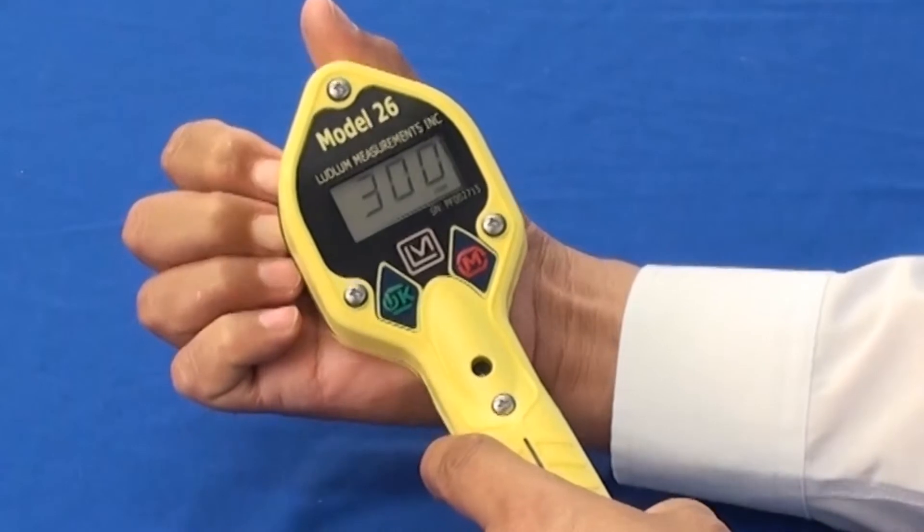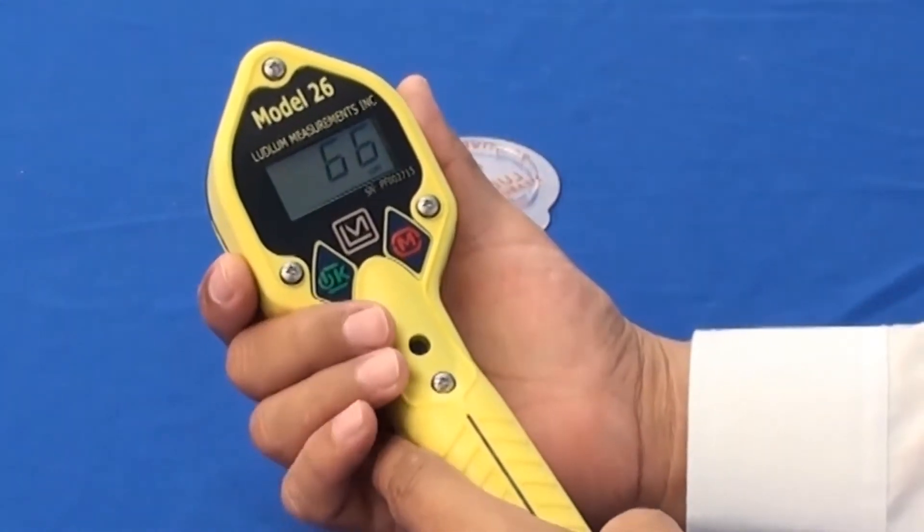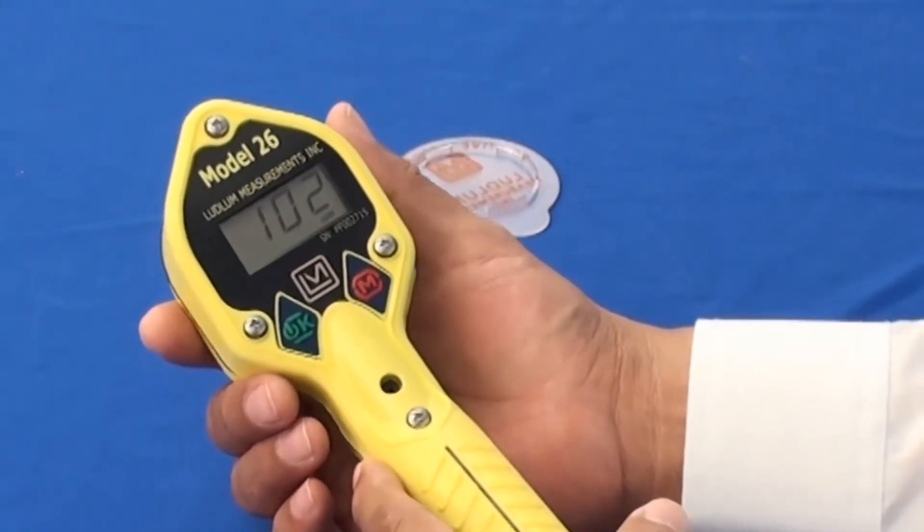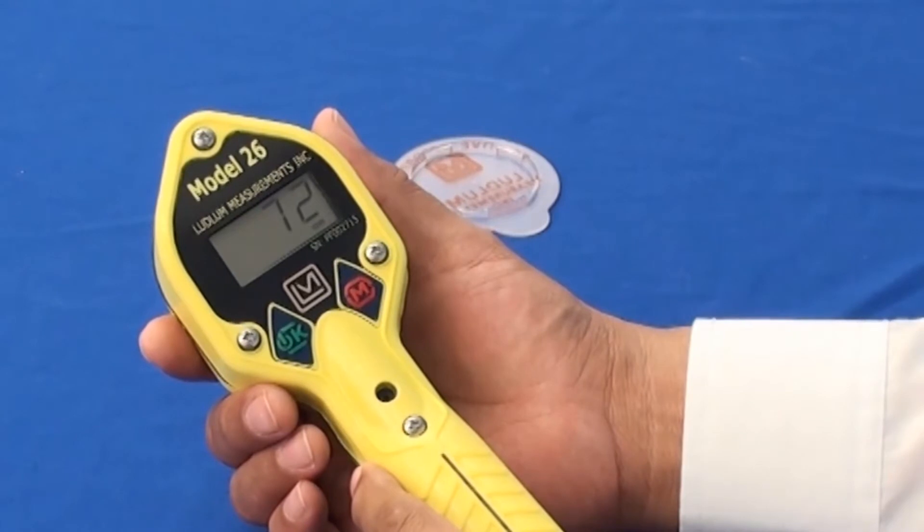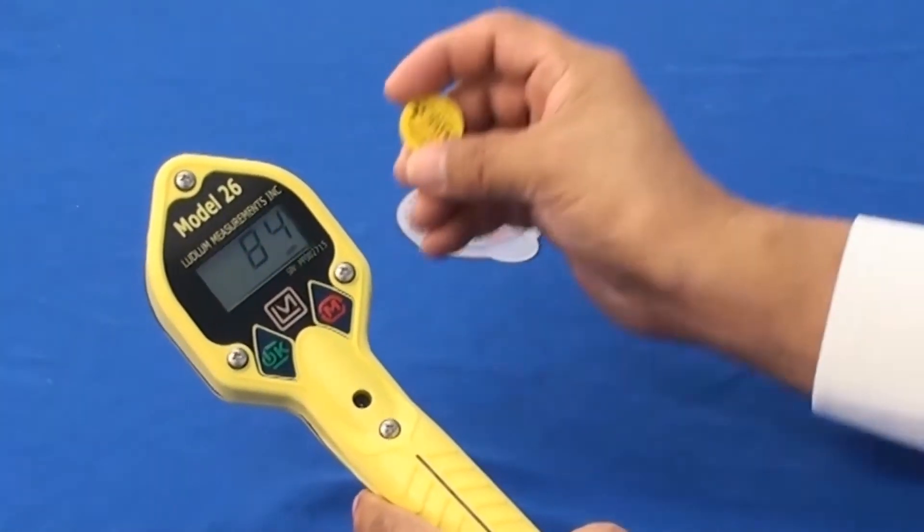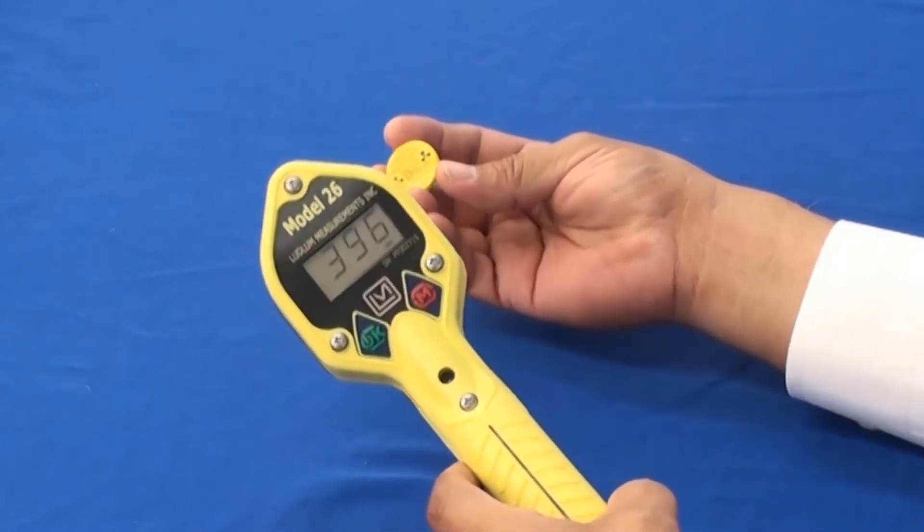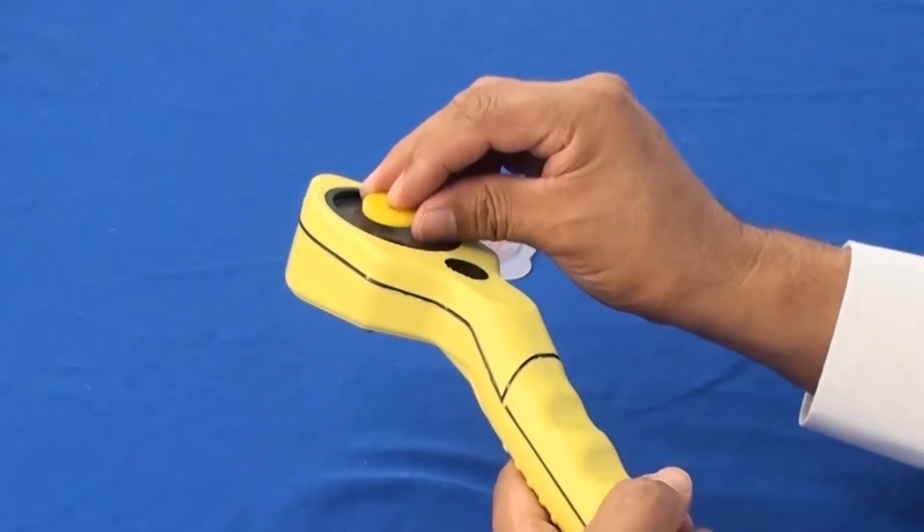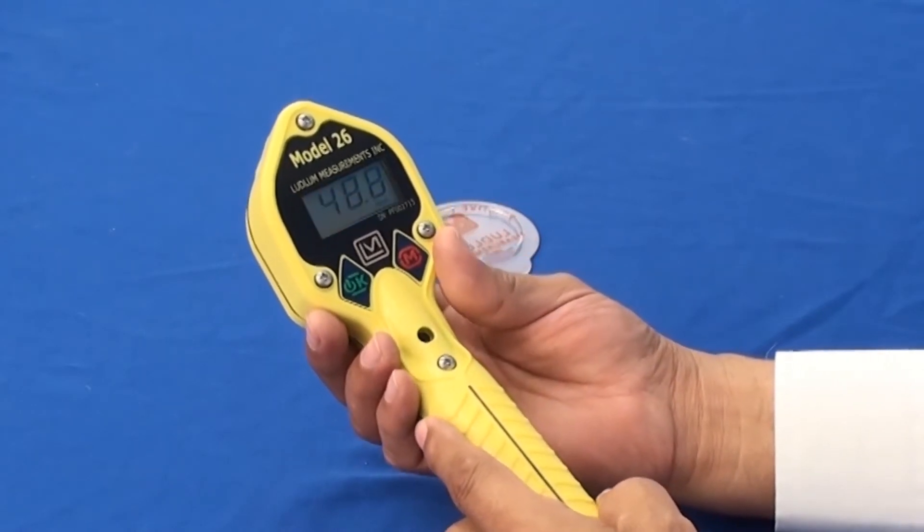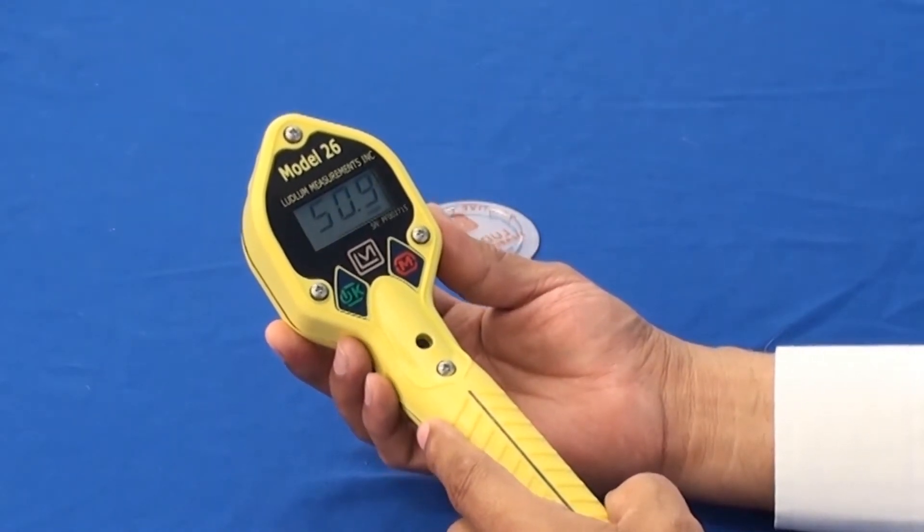With the purchase of your model 26, in the certificate of calibration, provided you've purchased a response check source, the factory will take the check source and do a factory response reading and document that in the comments section of your certificate of calibration. You would want to take note of the geometry or how the source was placed in relation to the detector. In this case, label side of source is placed on the protective screen to duplicate the readings that the factory did. You should be able to match the reading plus or minus 10 percent.